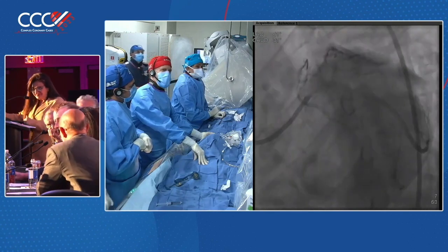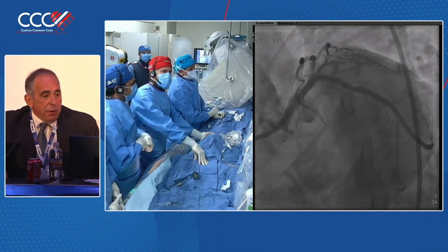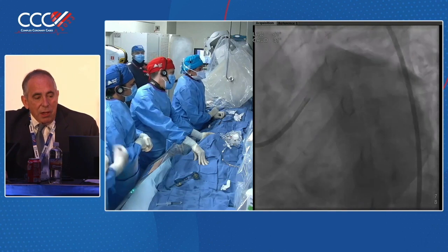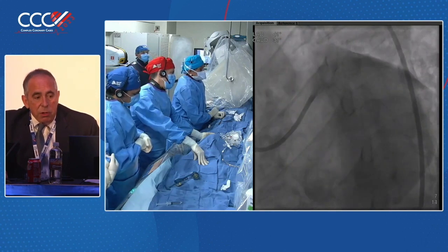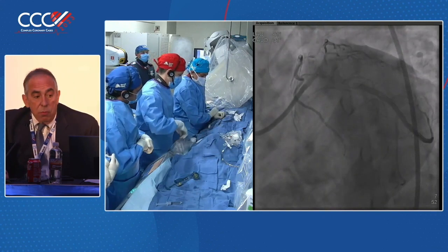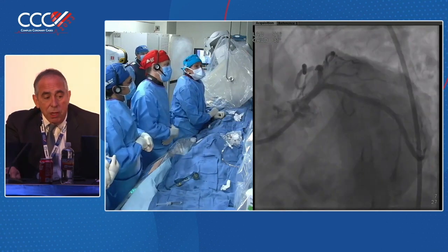I think the plan was that they've already outlined there's a mini crush, which is pretty reasonable. You're going to wire. Doesn't need any modification. Looks like there's a little bit of calcium in there. We'd probably like to try to IVUS the LAD, not only to determine the calcification, the extent, the circumferential amount, but also to help label exactly where the ostium of the LAD is, so that we don't encroach on the left main. So the biggest features here are not so much getting the diagonal and the LAD bifurcation, but making sure we don't mess up the other bifurcation.